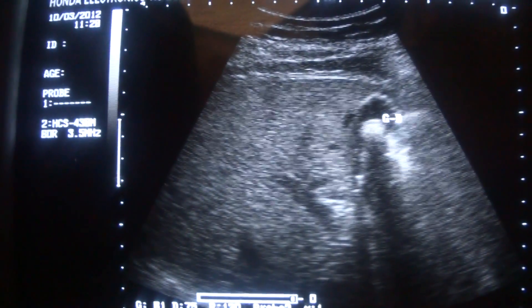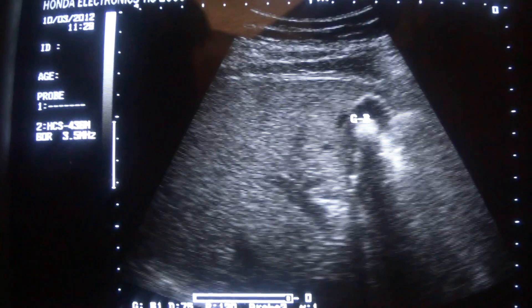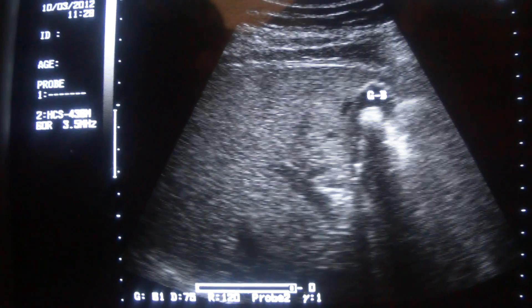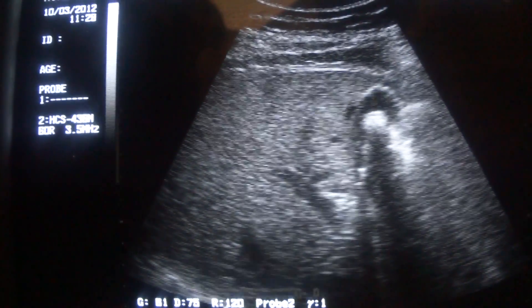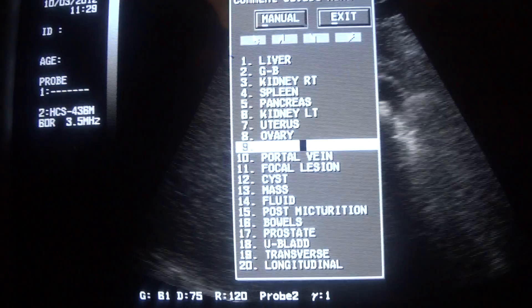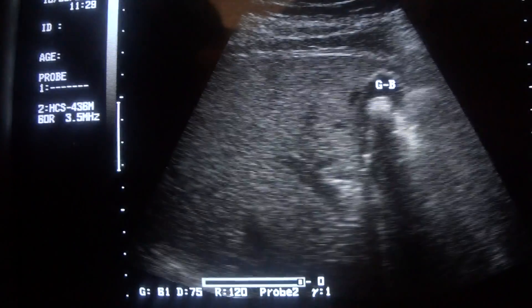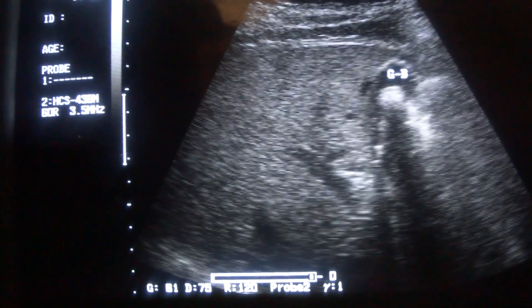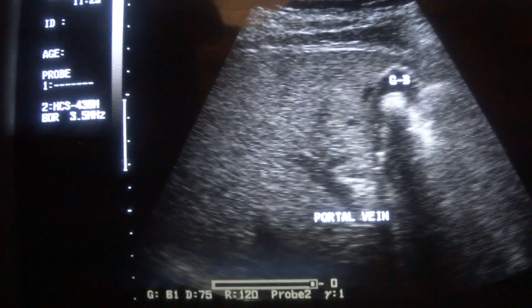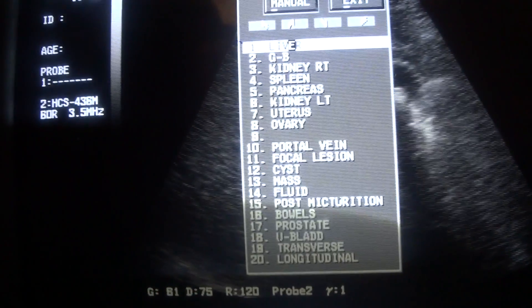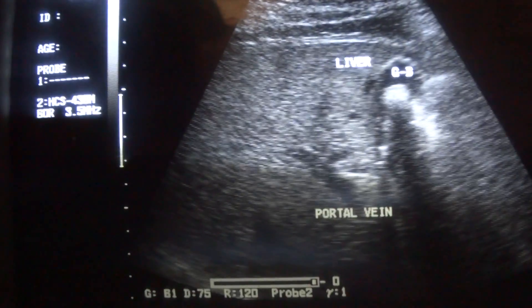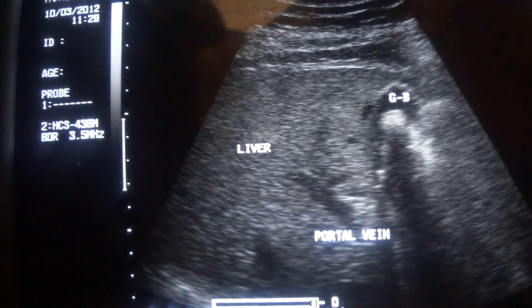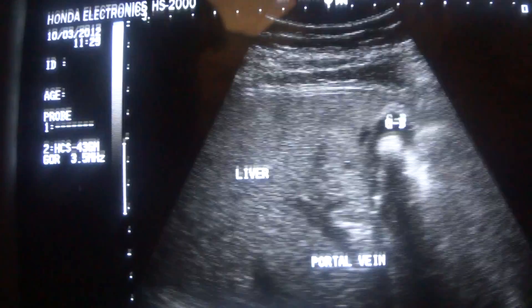This is the gallbladder. This tubular structure is the portal vein. This is the liver. Grading will be that it is fatty.